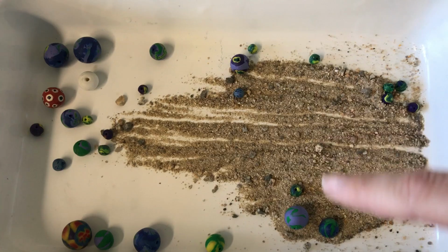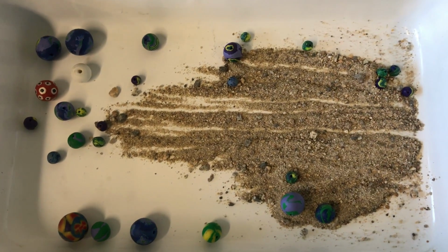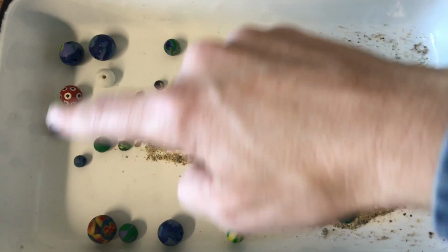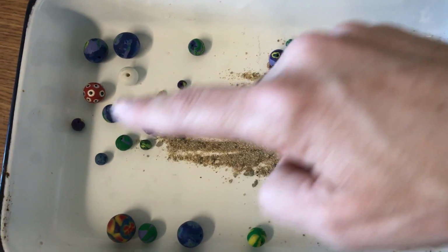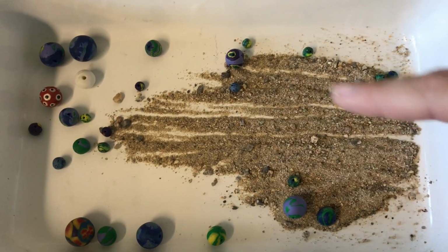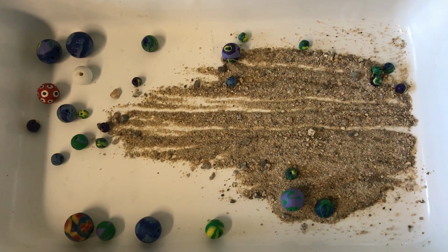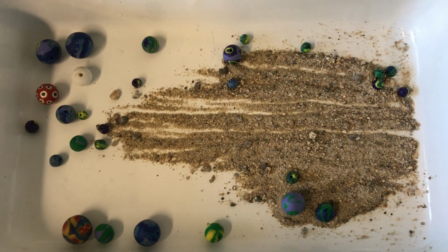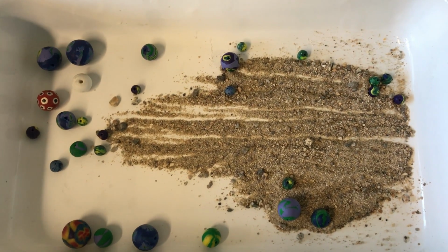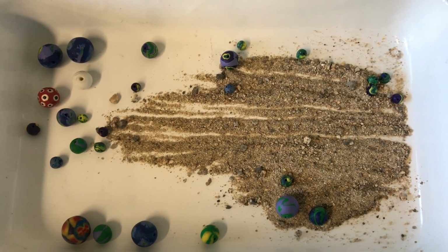All right, so we're just going to kind of think about what that means for actual blood, and think about what are the things that ended up way out here in the feathered edge, what determines what ends up in the feathered edge, and then what would be the nature of kind of being back in here. And we want to think about, when we're looking at a blood smear, which part of the blood smear should we look at to get sort of a typical view of what blood is like, because that's what we're trying to do with a smear.